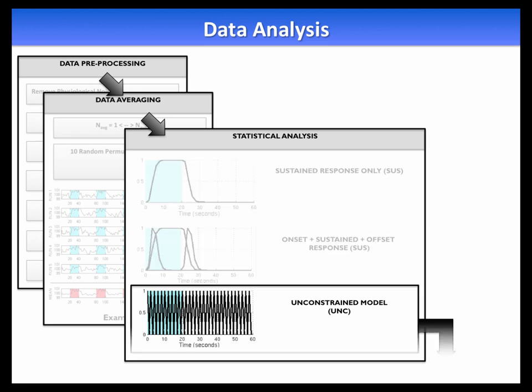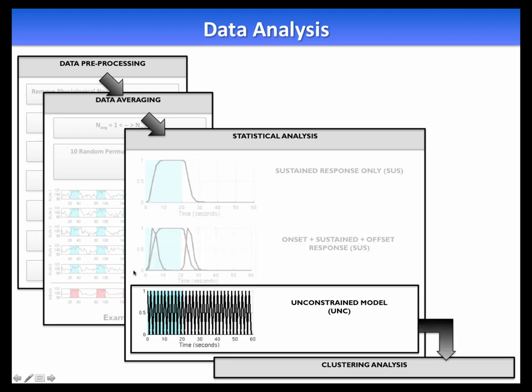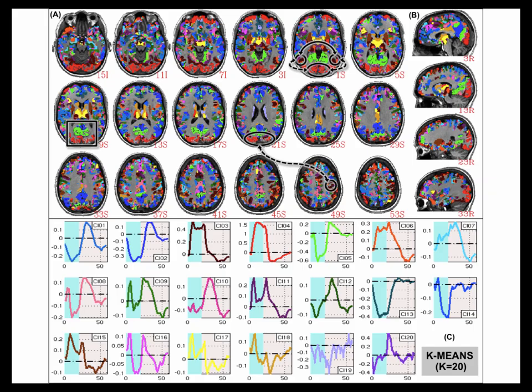So he did that, and with this data, it's hard to make sense of it unless you cluster the signal changes that look like each other. Okay, after averaging for 9 hours with that very, very simple task, he found this, which essentially was all of gray matter becomes activated or deactivated in some way.